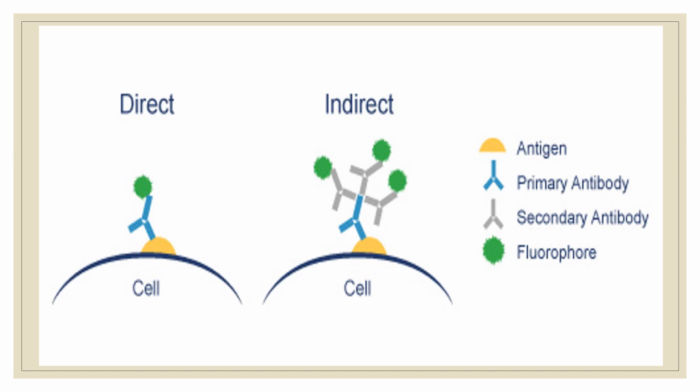Here we can compare the direct fluorescent antibody example to the indirect fluorescent antibody sample. You can see in the direct antibody sample, we have the cell that is a donor cell, and it is attached with antigen. And then the antibody and the fluorochrome link up to that antigen causing fluorescence. In the indirect test, here we have the cell, which is a donor cell, and antigen. We have the antibody that's attached to the antigen, and then we have secondary labeled antibodies with FITC.